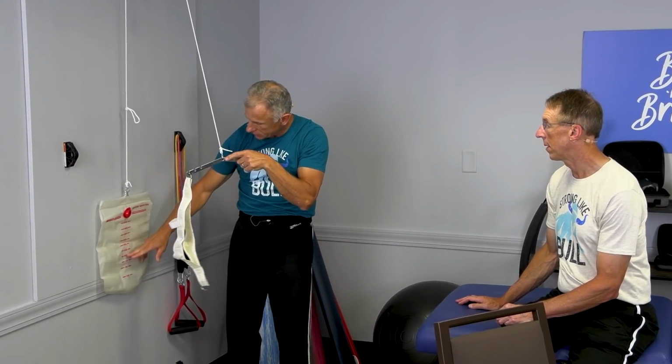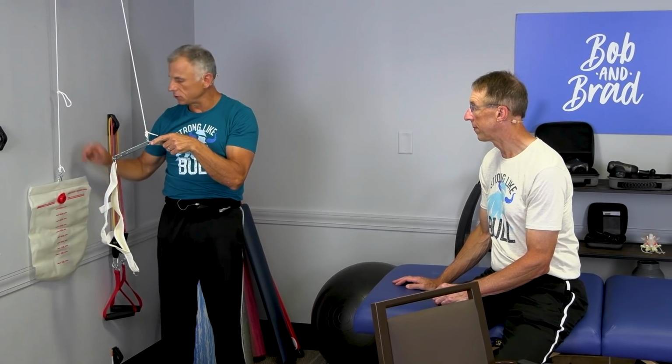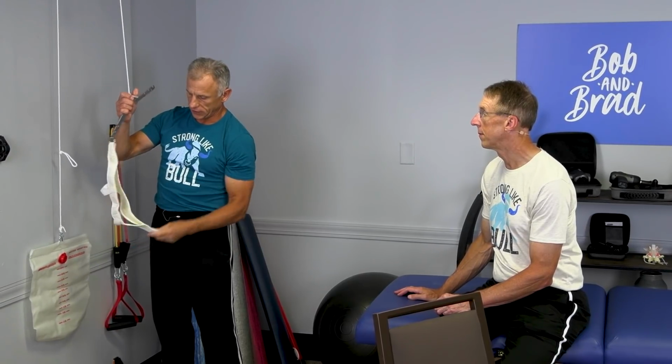It tells you you can go up to 20 pounds. Yep, and I usually start with 5 or 6 pounds. And so that goes down, and that pulls up. That offers the force for the traction. I'm not going to put this in, but this fits in your head around your jaw. It is comfortable. It is a little cumbersome.